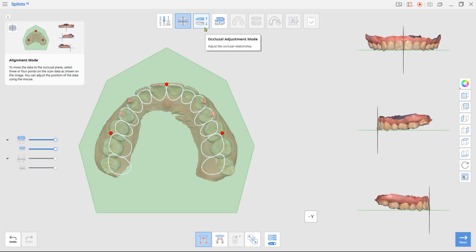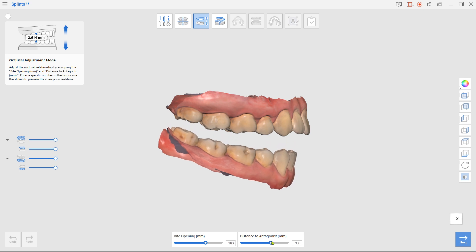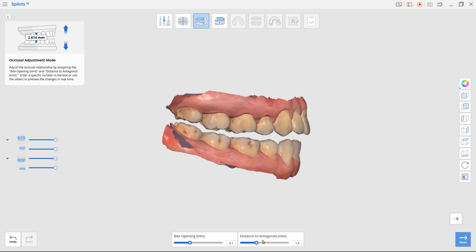And next, in the occlusal adjustment mode, you are going to give vertical thickness for your splint by opening the bite. Use the slider at the bottom or you can simply type in numbers.